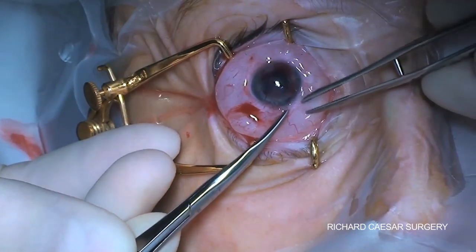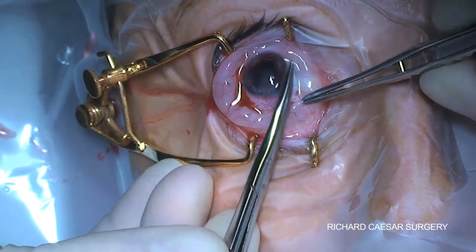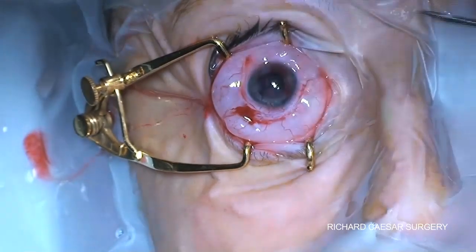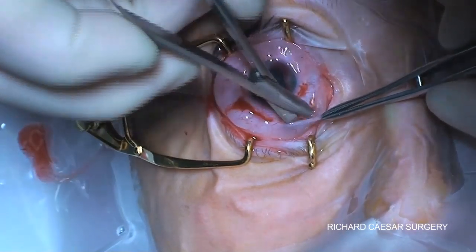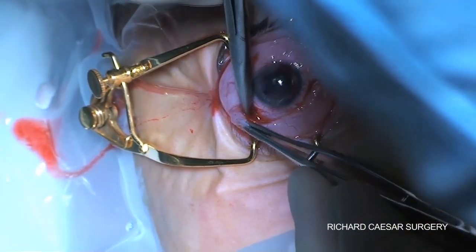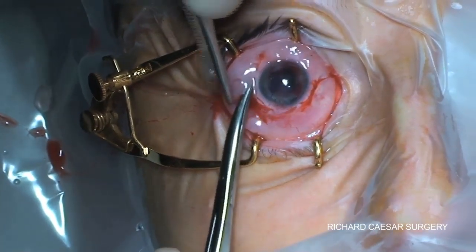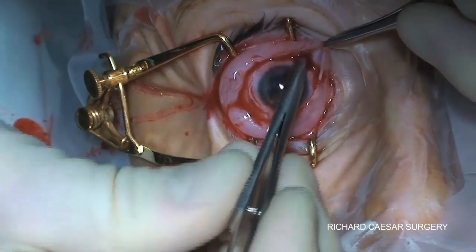The pocket is quite easily found in this patient inferiorly but is a little bit more difficult superiorly as that's the site of previous surgery. If a patient has had extensive previous attempts with VR surgery to reattach a retina, then often the tissues can be very bound down and this dissection is significantly more difficult. Even for an evisceration it's still worth freeing the conjunctiva and Tenon's and clearing the pocket between the muscles to make the end closure as effortless as possible.